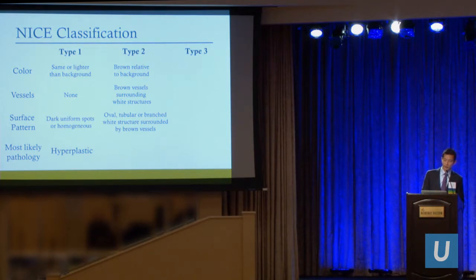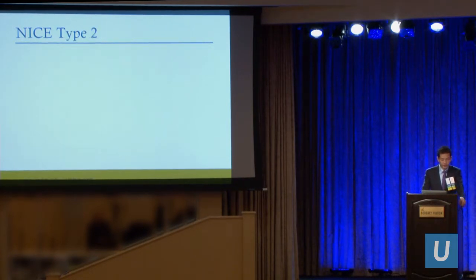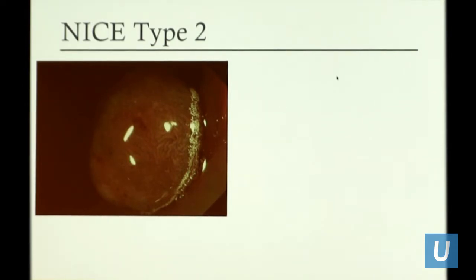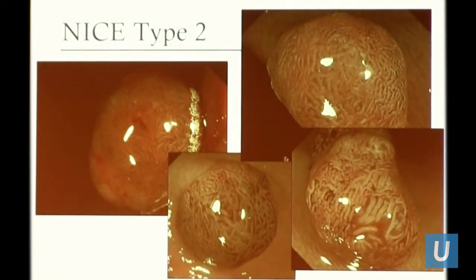Type 2: the polyp color is brown relative to the background, darker. There are brown vessels surrounding white structures. The surface pattern shows oval or tubular branched white structures surrounded by brown vessels — this is an adenoma. Here's a polyp in white light, then narrowband imaging showing that surface pattern — you can appreciate the organized tubular structures, sometimes looking like a little brain. It's darker than the surrounding area, and you can see the overlying surface pattern consistent with an adenoma.